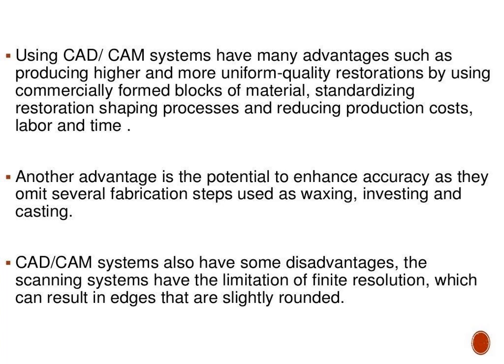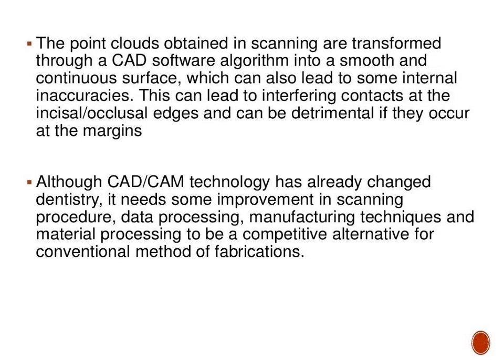The scanning systems have the limitation of finite resolution, which can result in edges that are slightly rounded. The point clouds obtained in scanning are transformed through a CAD software system algorithm into a smooth and continuous surface, which can also lead to some internal inaccuracies. This can lead to interfering contacts at the incisal or occlusal edges and can be detrimental if they occur at the margins. Although CAD/CAM technology has already changed dentistry, it needs some improvement in scanning procedure, data processing, manufacturing techniques, and material processing to be a competitive alternative for conventional methods of fabrication.